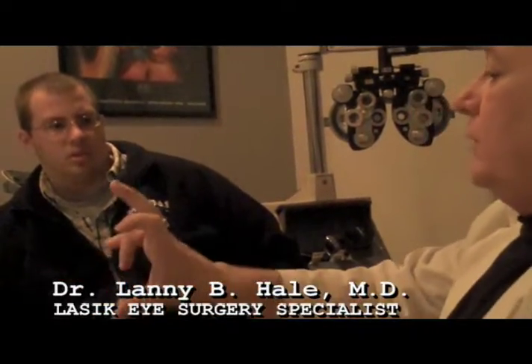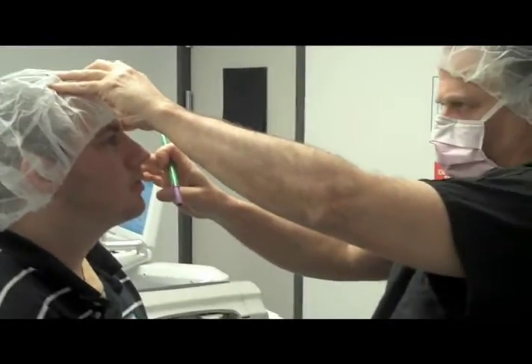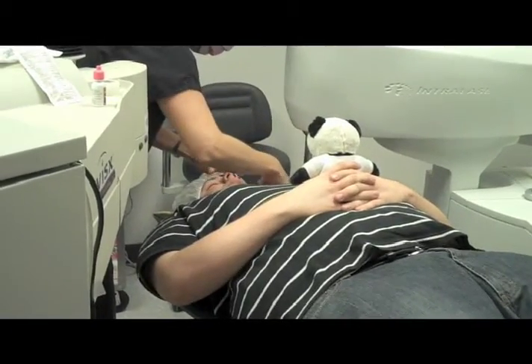So you're going to sit on the little edge of the chair. I'm going to come at you with a little sterilized skin marker and actually put little dots on the white part of your eye so I get a vertical alignment guide. So I will put these little dots on you. They will lay you back on this little chair. I'm going to put a little pillow around your head and neck, a little deflatable thing. I'm going to cover up one eye.